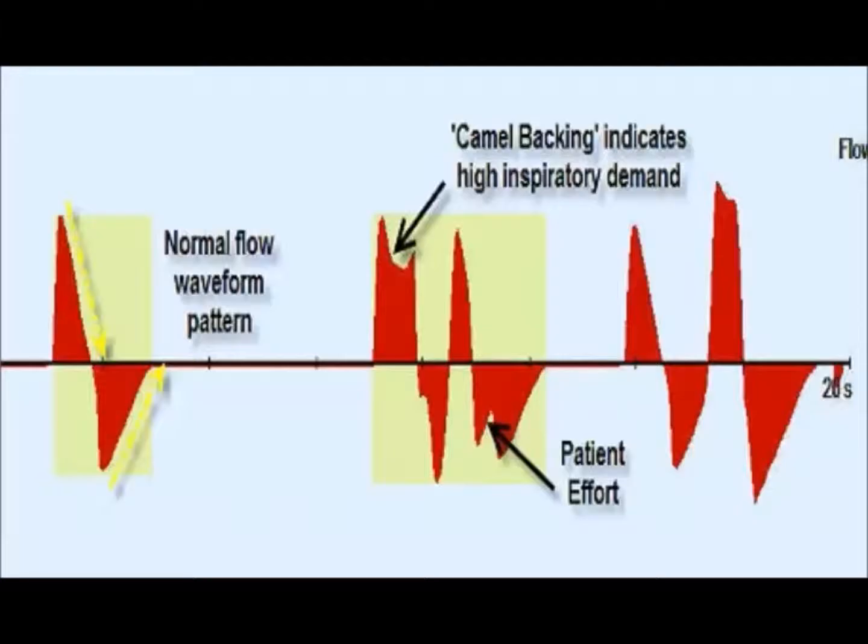And this is looking at driving pressure. So we might have the ventilator mode itself provide unrestricted inspiratory flow, but there's still an issue with driving pressure, and that's related to the fact that you can only get so much flow based on a driving pressure. So you can still have asynchronies with driving pressure in a pressure control mode if the driving pressure is too low for the patient's inspiratory demand.